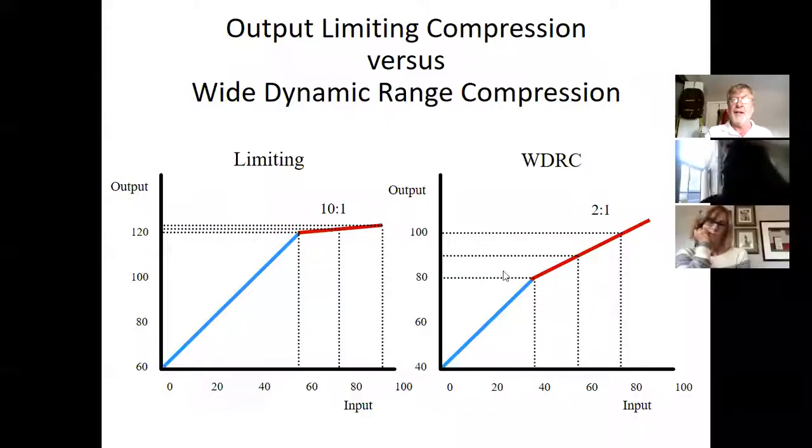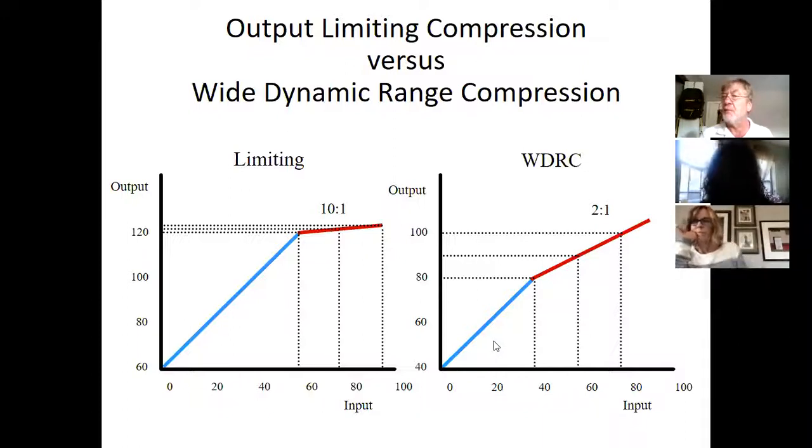So now you're looking at WDRC for your typical mild to moderate sensory neural loss. And what's happening here? In this case, we're looking at a gain of 40. And that's linear gain. And always read that as maximum gain. This is the max. And let's say this is at user volume setting. Please don't think this has to mean that you crank the hearing aid full up. Just set the volume to wherever the guy's comfortable. Maybe the hearing aid doesn't even have a volume control. Some hearing aids today don't even have them.